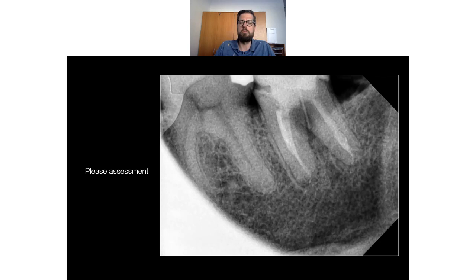But we see that in the periapical area there is no lesion, but we see a pus discharge from the place between the roots. So it can be a periodontal problem or it can be a via falsa. So somebody, for example, could have made a cut with a burr through the hard dental tissue. So this is the question. We cannot tell only by X-ray, but we must look inside.